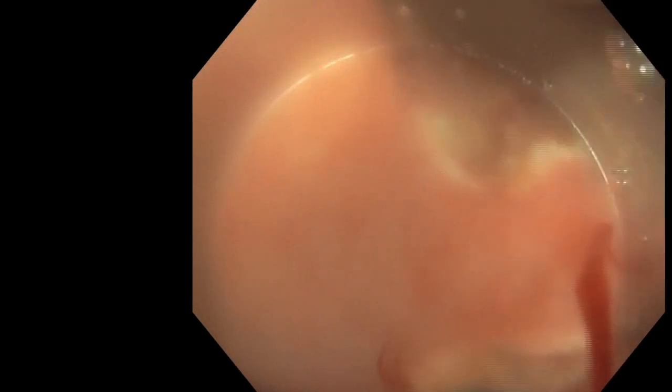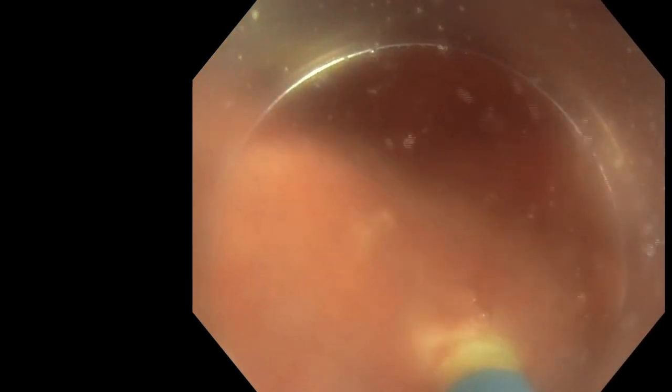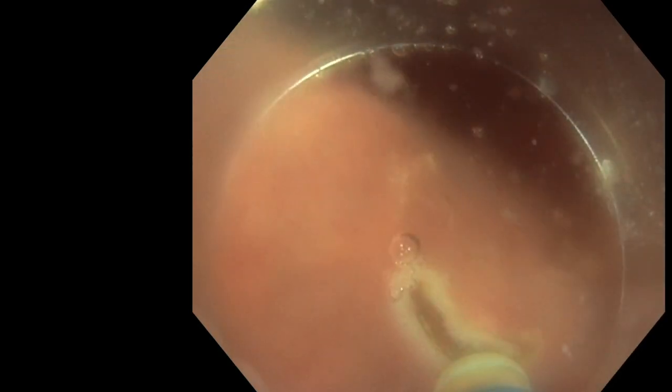So here a small bleeding during this kind of incision, so I needed to coagulate this area. Okay, one on the opposite side, and usually one clip is almost enough to close the diverticula, and after I use 2 or 3, I don't know, to complete the closure and be sure that there is no delayed damage of the muscle.